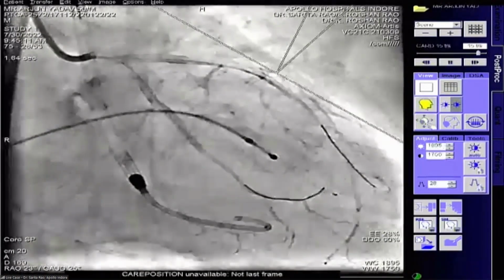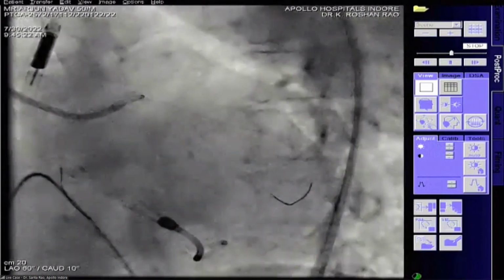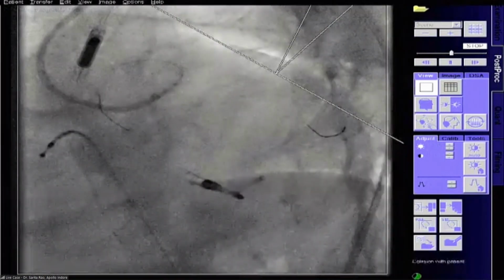Anyway, the data also shows that everything need not be done in one go. You can stage it also. But I will leave it to you, madam. I think once you show us the final picture, we would congratulate you. Okay.